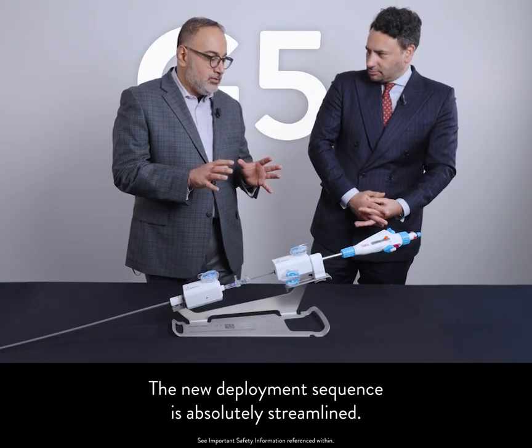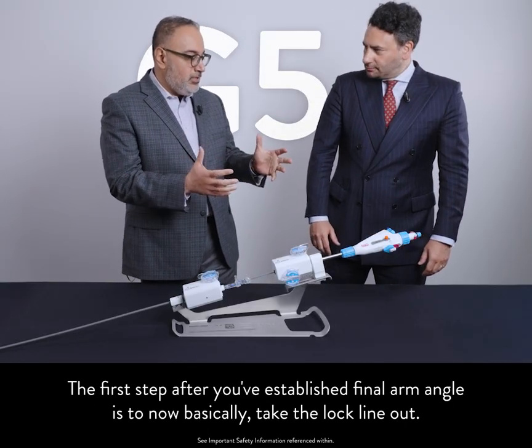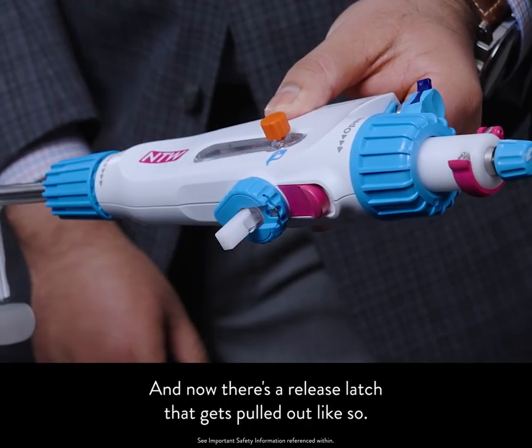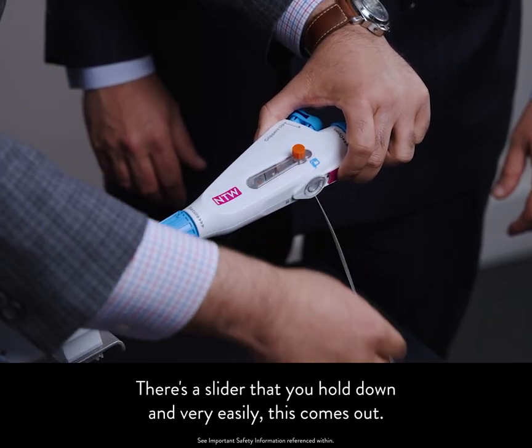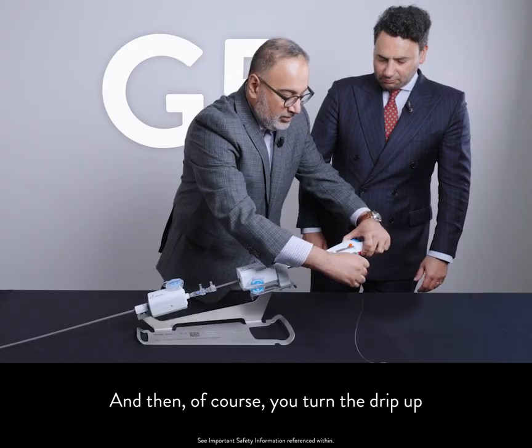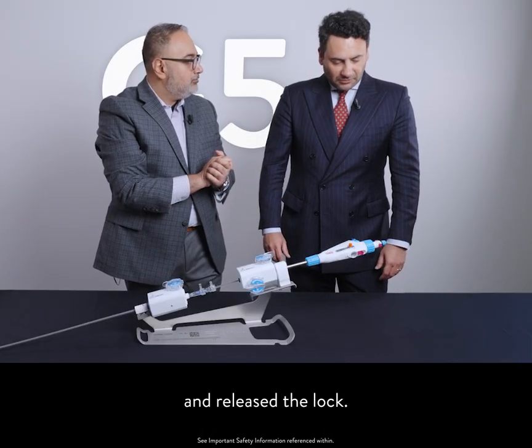The new deployment sequence is absolutely streamlined. Just like every fantastic grasp you get, as soon as you're happy with leaflet insertion and ready to do the deployment sequence, the first step after establishing final arm angle is to take the lock line out. There's a release latch that gets pulled out, and a slider that you hold down — very easily it comes out. No more struggling to identify the suture, no more struggling to take off the plastic tubes. In a very nice streamlined way, we've done the final arm angle number one and released the lock. Much more easy.